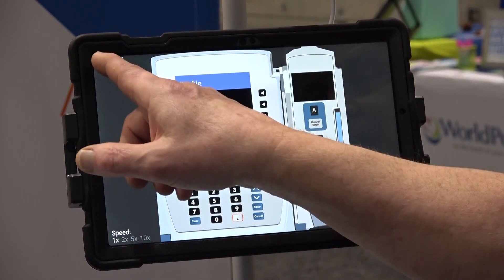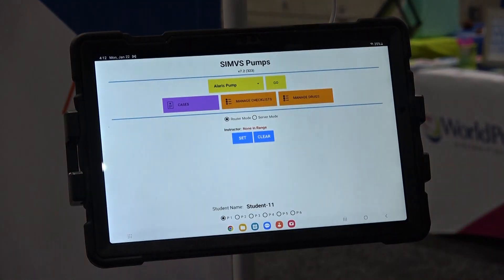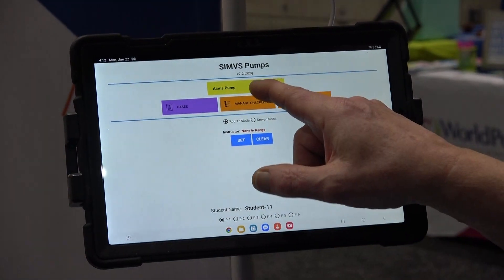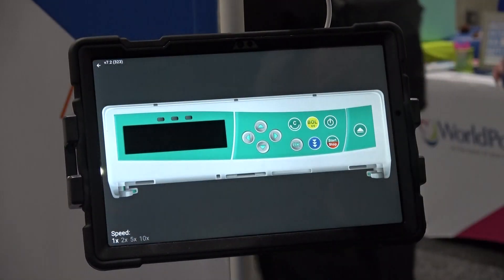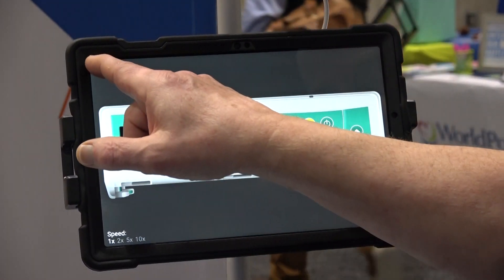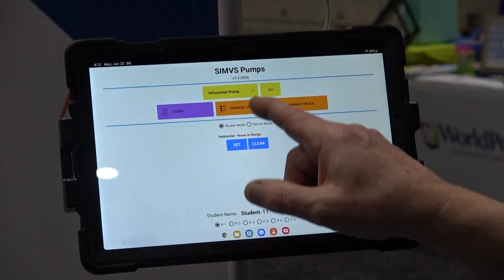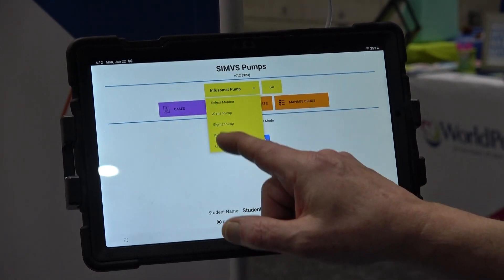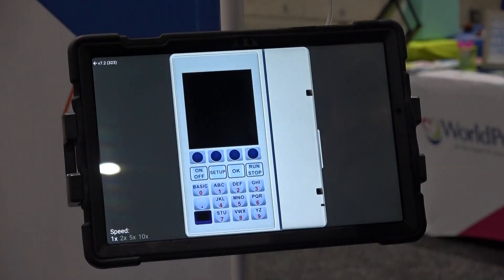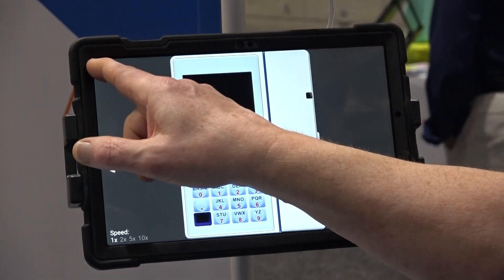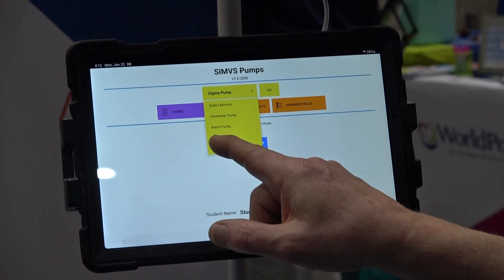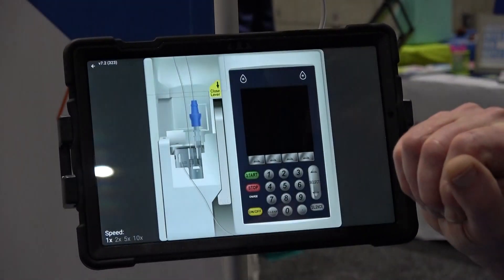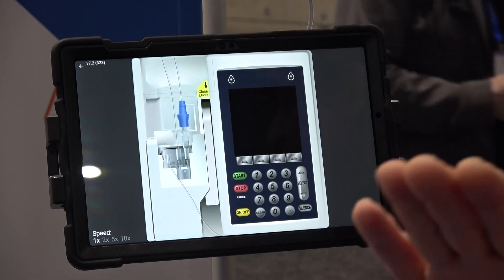That's our Alaris, and here we have the Infusomat, the Sigma, and the Plum — the four most common interfaces.